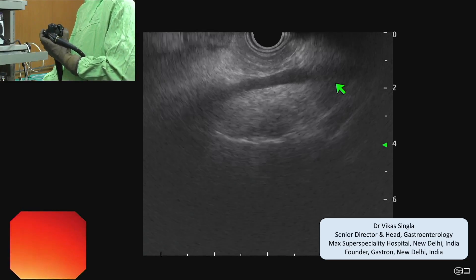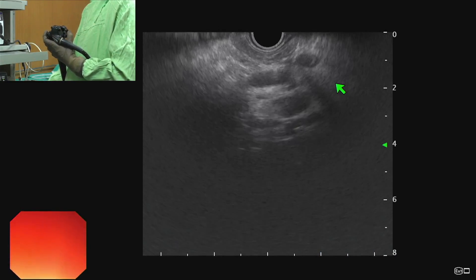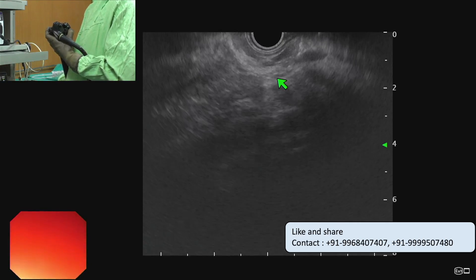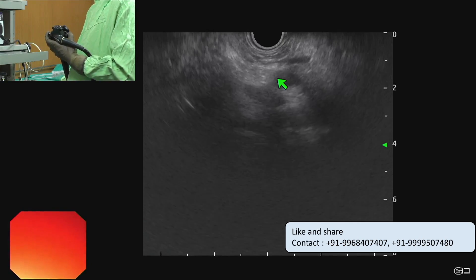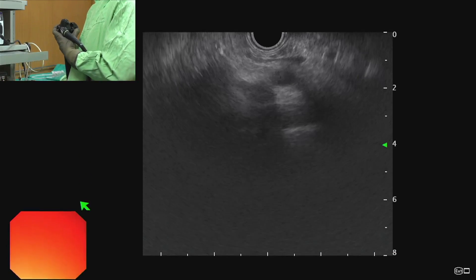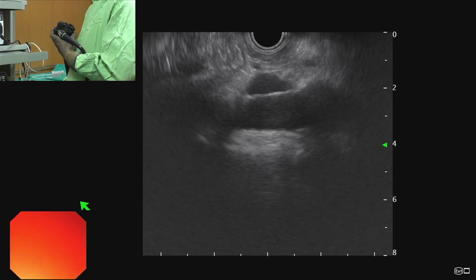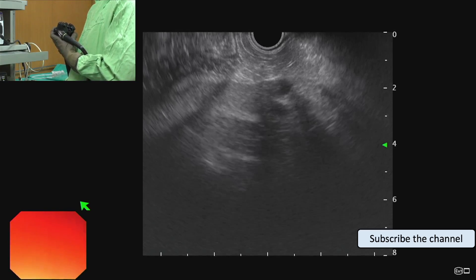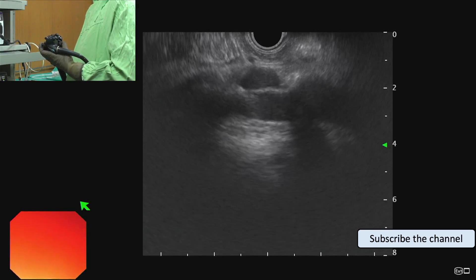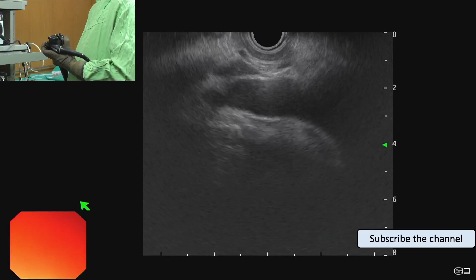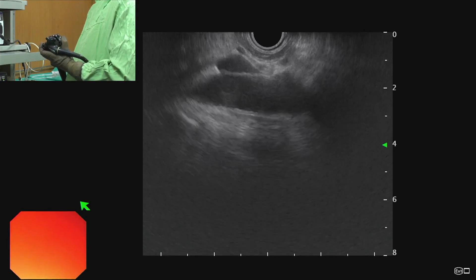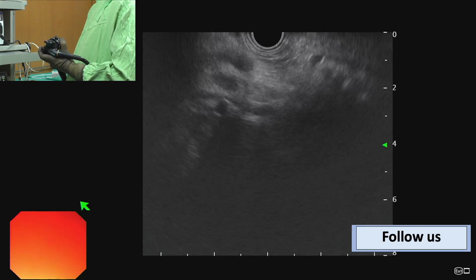If we see the SMV and give a clockwise torque we can see the SMA. If we trace back the SMA by clockwise torque and pulling back, it will join the aorta. Here we can see the SMA joining with the aorta. Just proximal to the origin of the SMA from the aorta will be the origin of the celiac trunk.